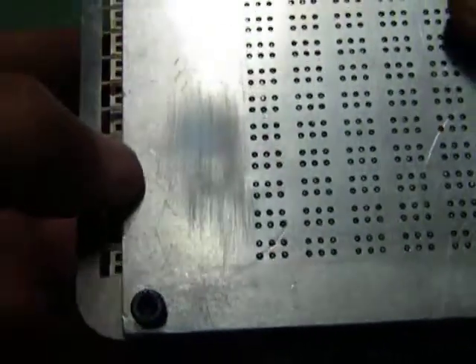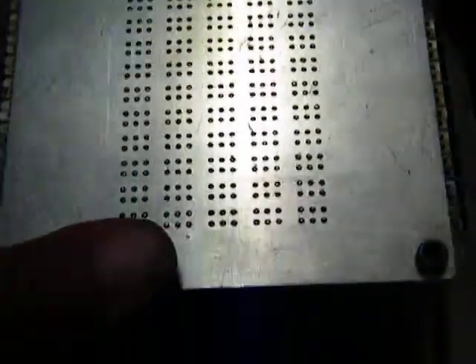That's a slide guide over there, and the column slides, as you can see in the other videos, are very, very thin little things. And those are the row actuators, one end of them, and then at the other end of the display, you get the other end of the row actuators. So that's basically what this device is about.